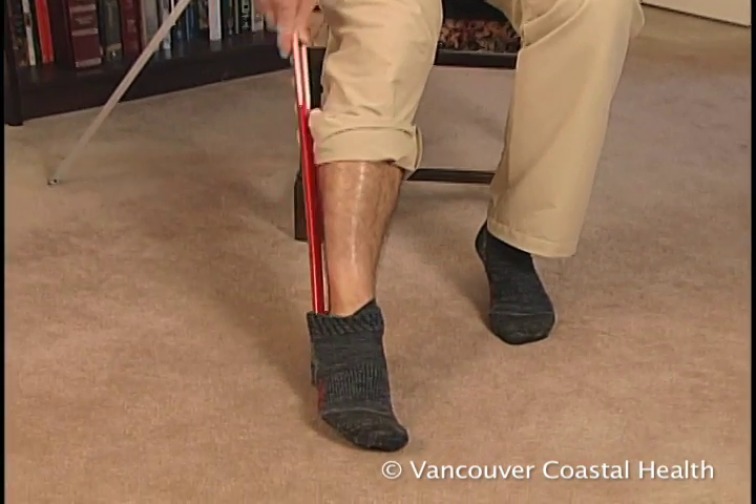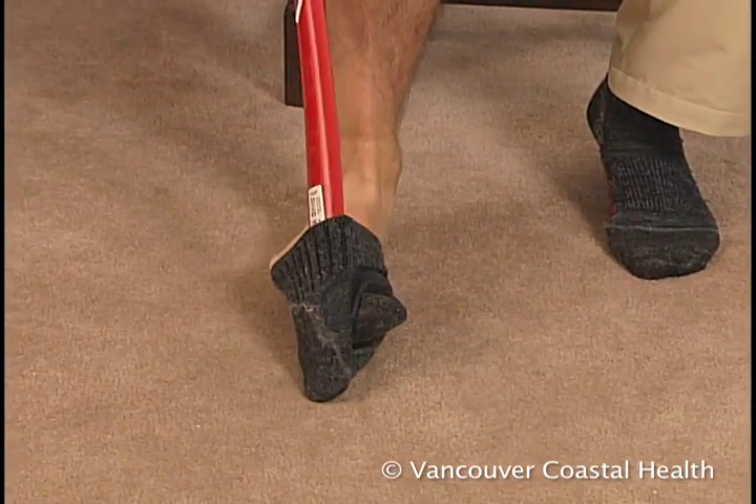To remove socks, just slip a long shoe horn into the sock behind the heel.